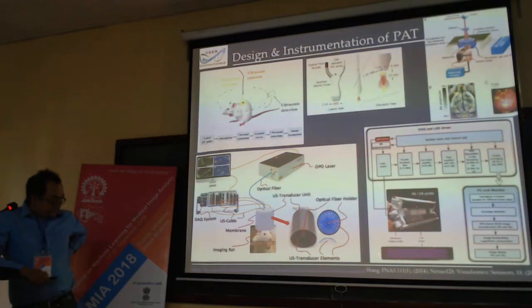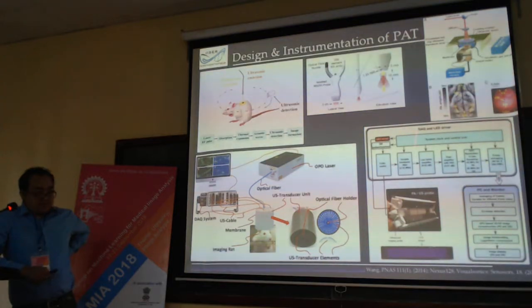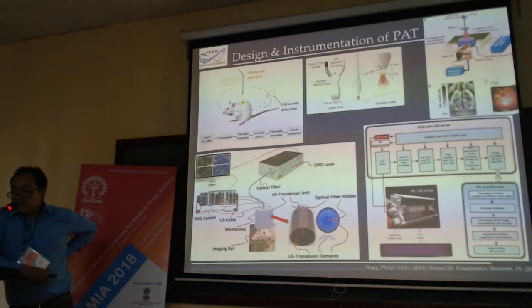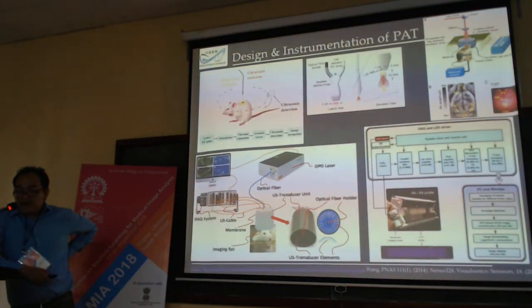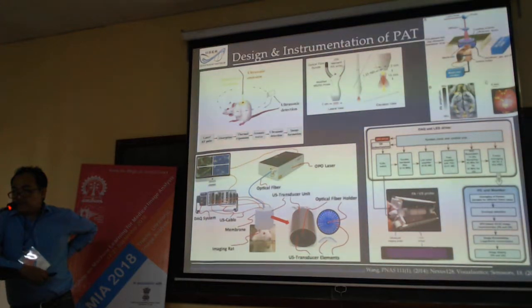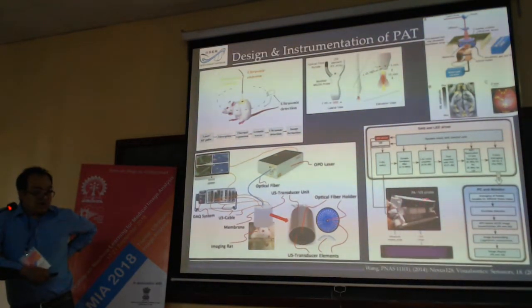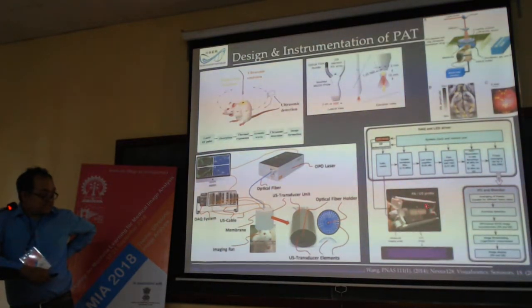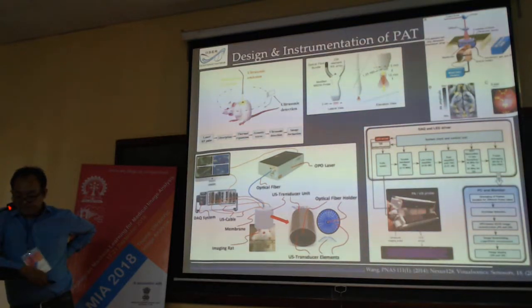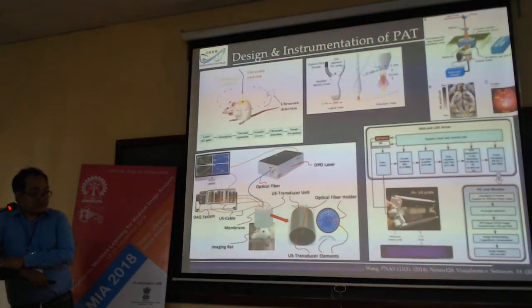And very recently, as I observed in the literature, I am not sure whether I marked the reference, instead of the laser, people started using LEDs for the light illumination. The challenge is that the laser is quite voluminous in energy, so the energy over a certain area is very high. That is not easy to achieve with an LED, so they use a good number of LEDs for illumination. So this is with the conventional ultrasound transducers. I would like to say these are the state of the art for photoacoustic tomography.